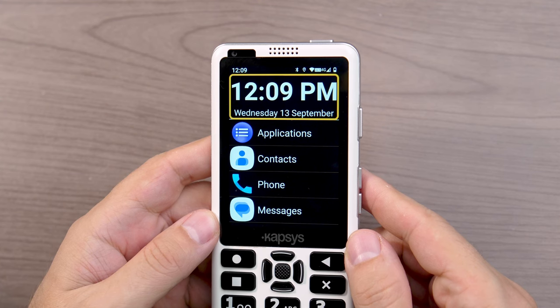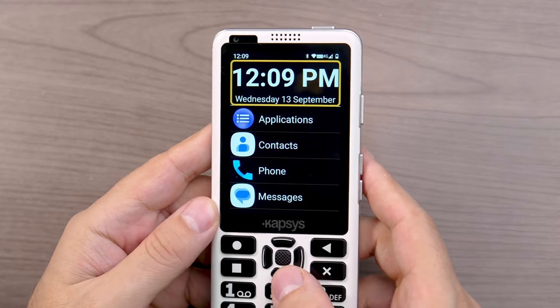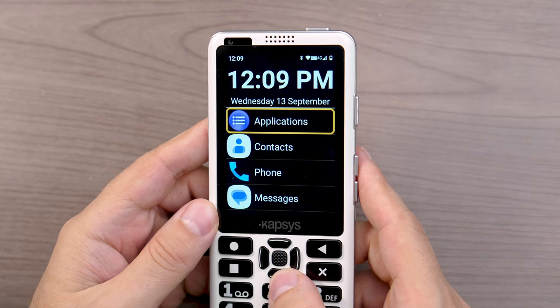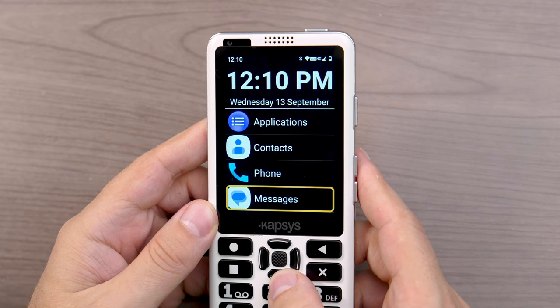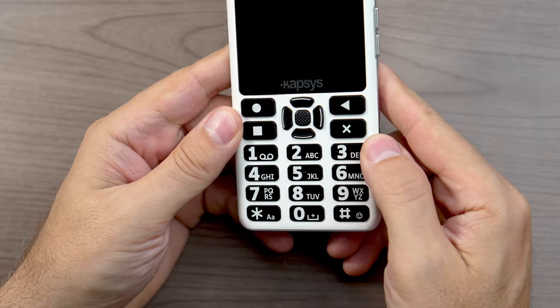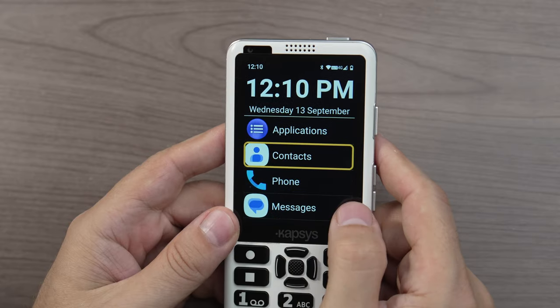You'll also notice that the TalkBack screen reader is automatically turned on. On the home screen we have a couple of elements: at the top, a very large digital clock and date, and below that a few of our most used applications — Applications list, Contacts, Phone, and Messages. There are two ways to interact with the phone: you can use the physical keypad with up and down navigation buttons, OK button, menu, and back, or you can use gestures on the touchscreen using all the normal TalkBack gestures.